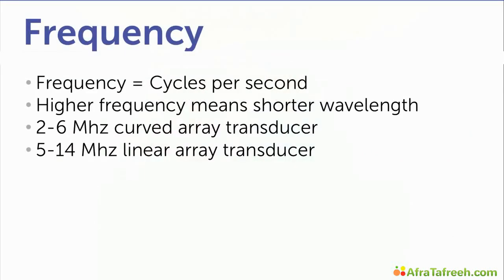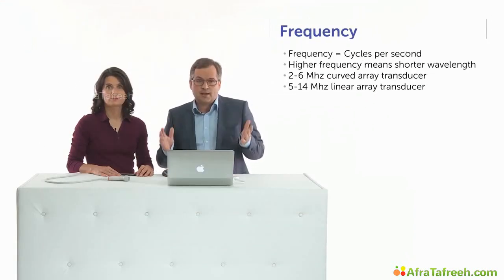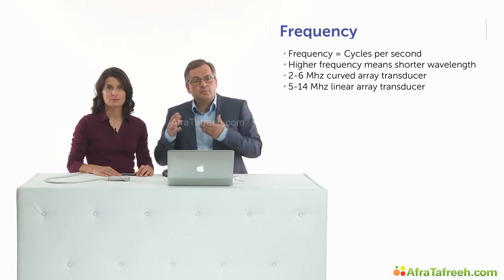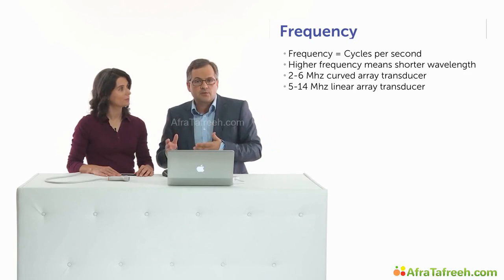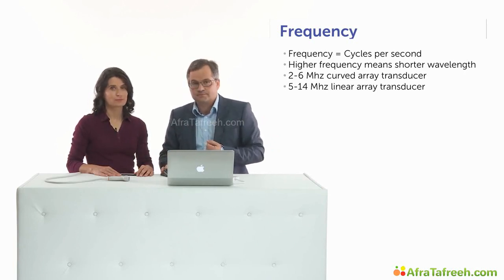Let's go in for some important details. It is essential that the sound will penetrate the whole organ, because also deep structures, for instance in the liver, must be reached. Sound waves of a long wavelength, that is, for a lower frequency, penetrate deeper into the body. These sound waves are used to examine structures far from the transducer.